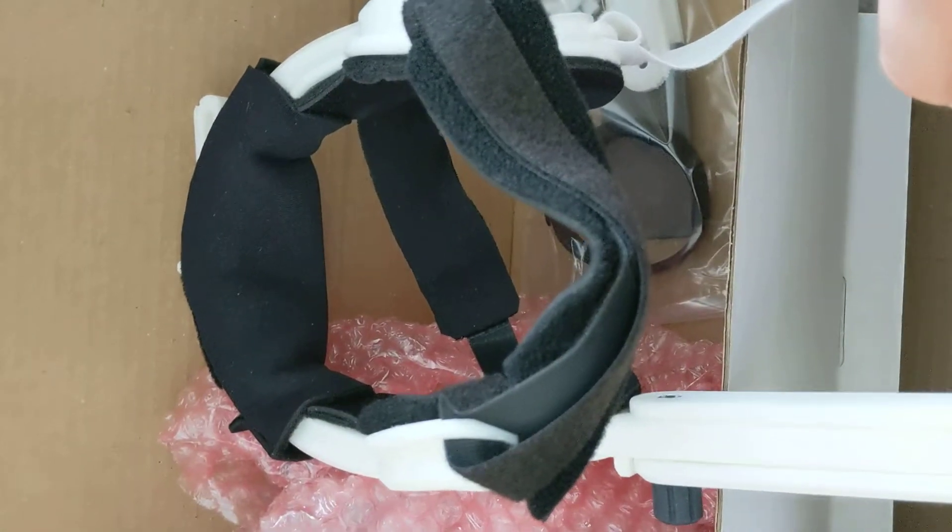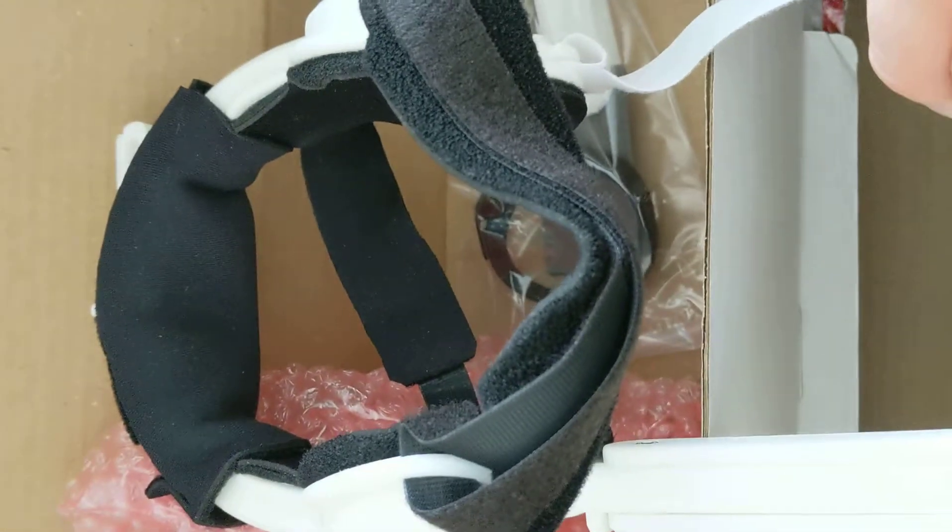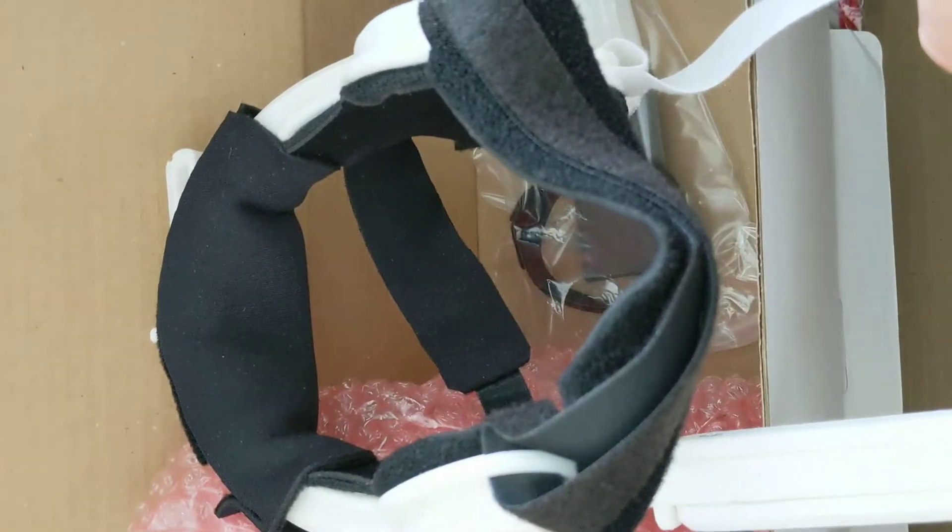Last but not least, we have something that's difficult to open. Should've rehearsed this. There it is — the new, handy dandy, lightweight plastic headset. Probably more suitable for doing recordings with kids than the old metal one that I have. So there you go. If you want to buy yourself an ultrasound research unit, that's what you're going to get.